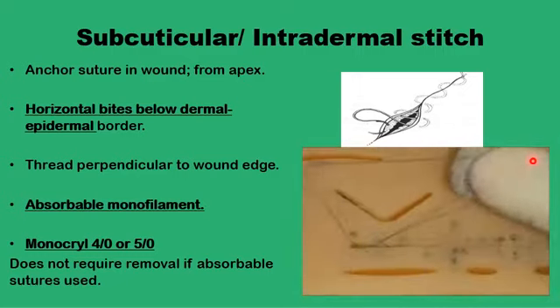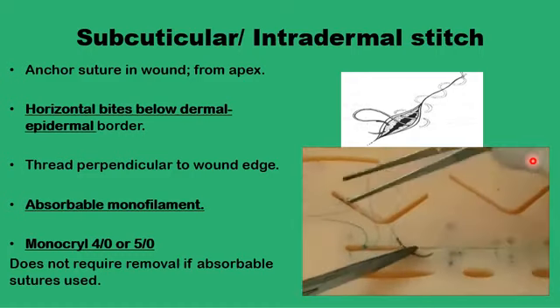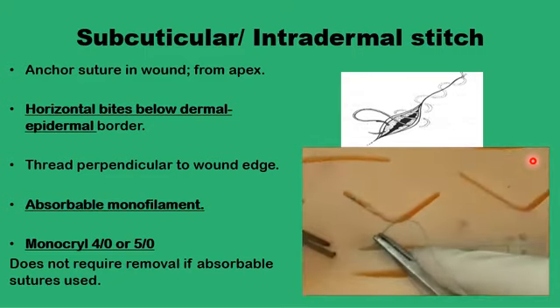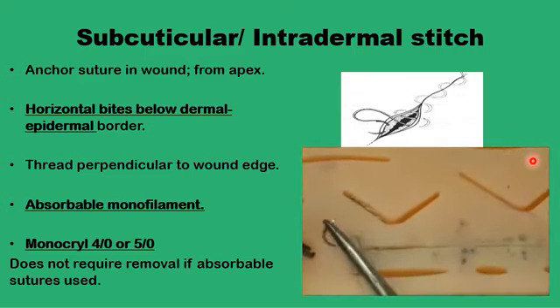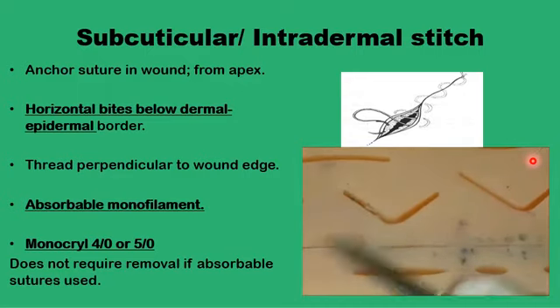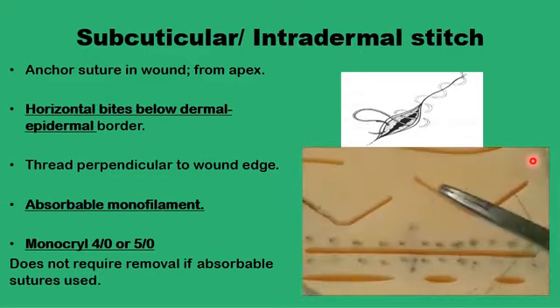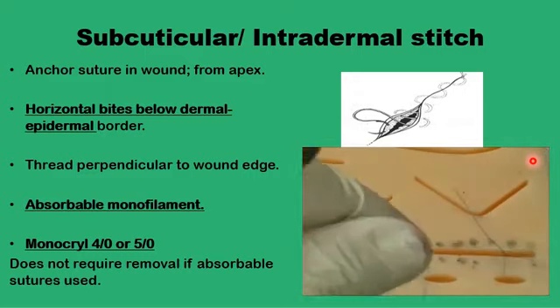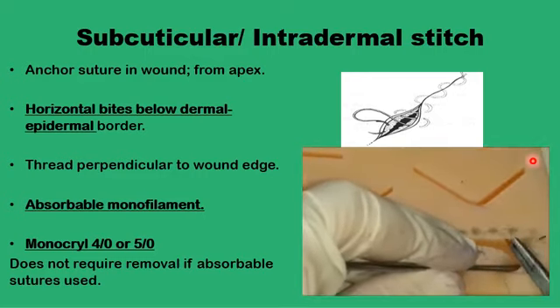and then a finalizing suture again into the subcutaneous tissue in here to provide stability to the suture line, followed by the Aberdeen knot, and then you retrieve the needle through the last loop, get it out, pass it through the apex of the wound or anywhere beyond the apex to bury the knot, and then cut the suture flush with the surface.